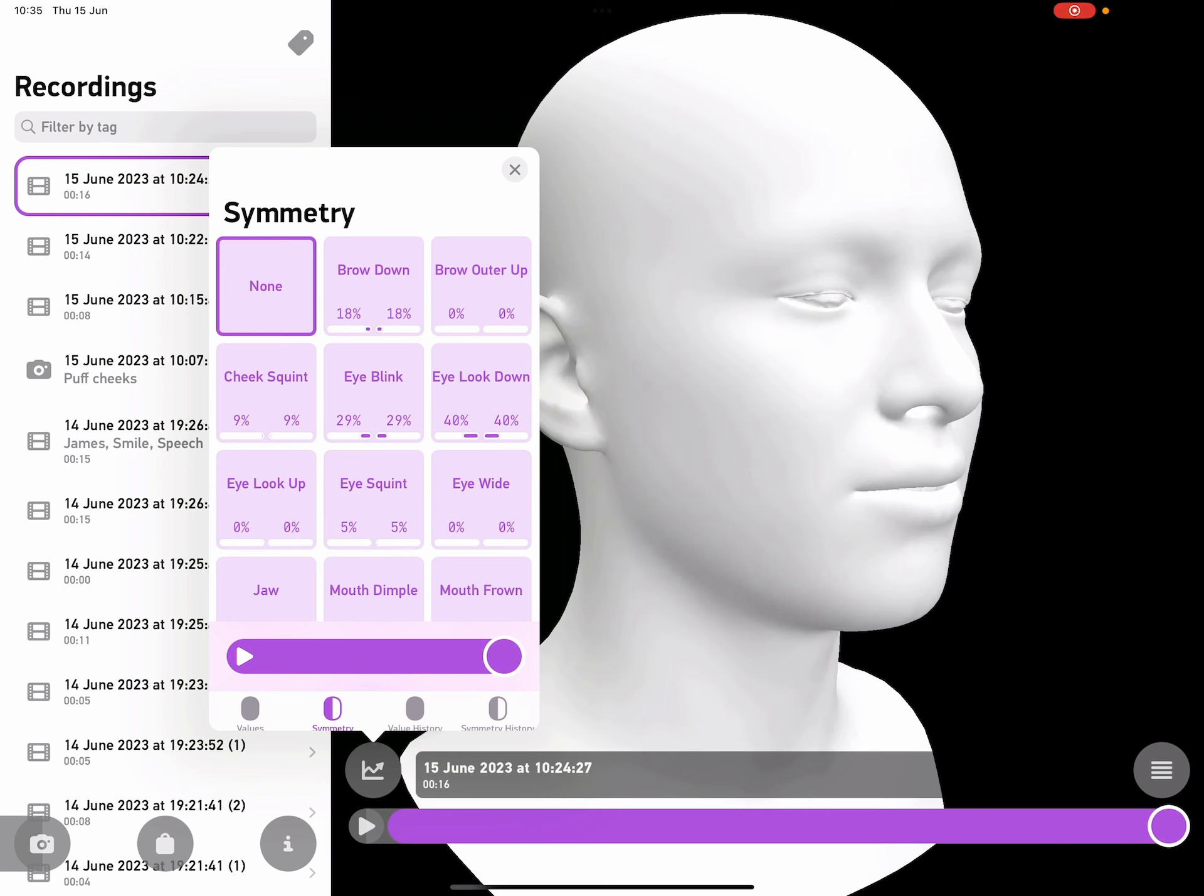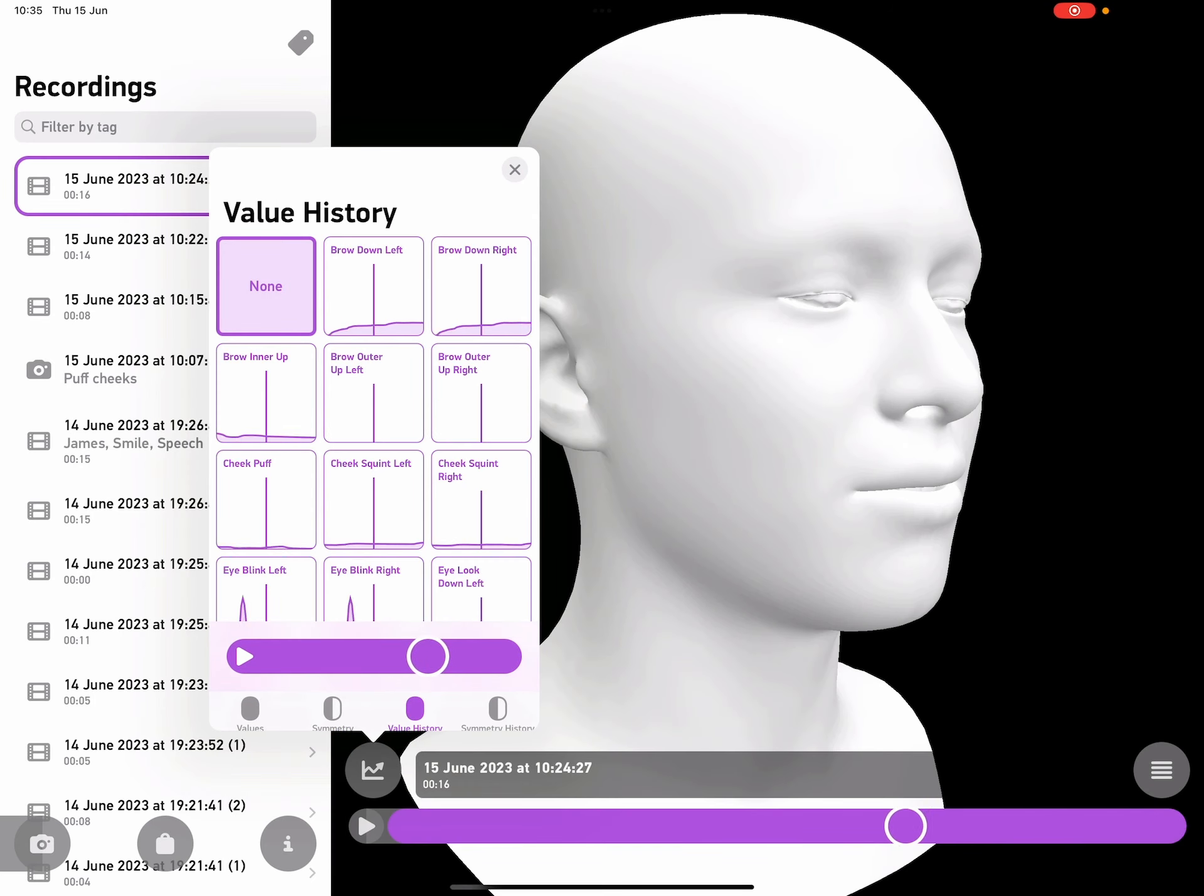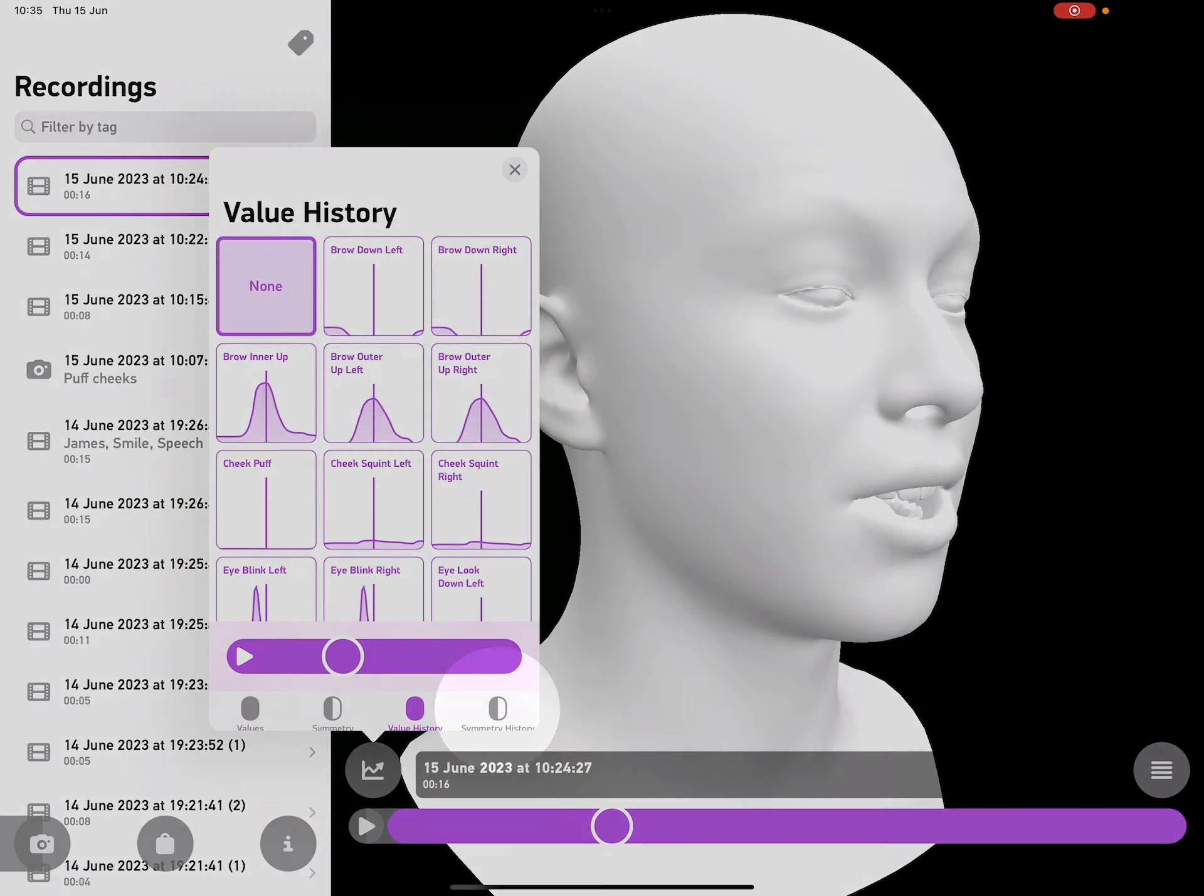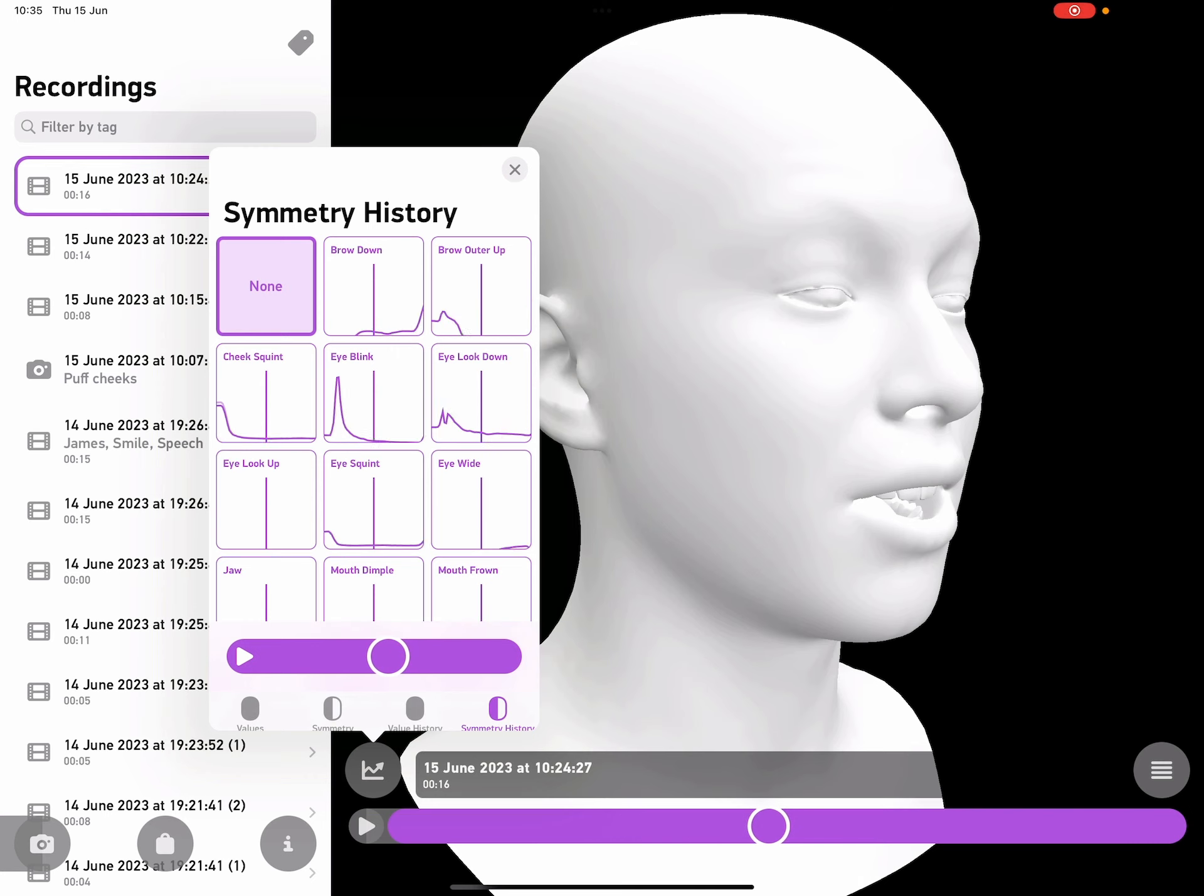If I want to see a bit more detail, I can tap on the value history tab and now I can pan through a graph of the values that I was recording. I can tap on the symmetry history tab and then see similar graphs for all the symmetrical locations.